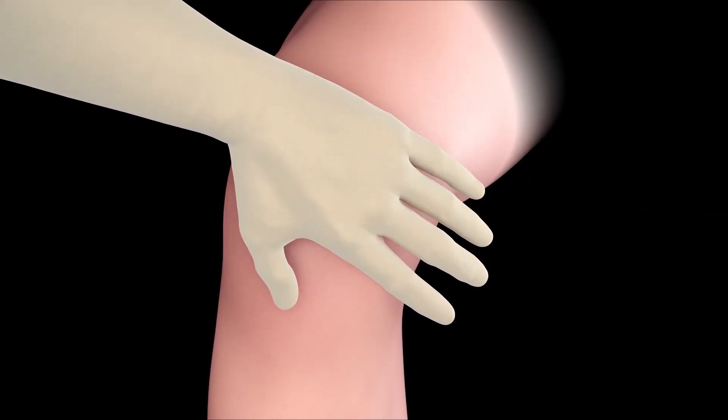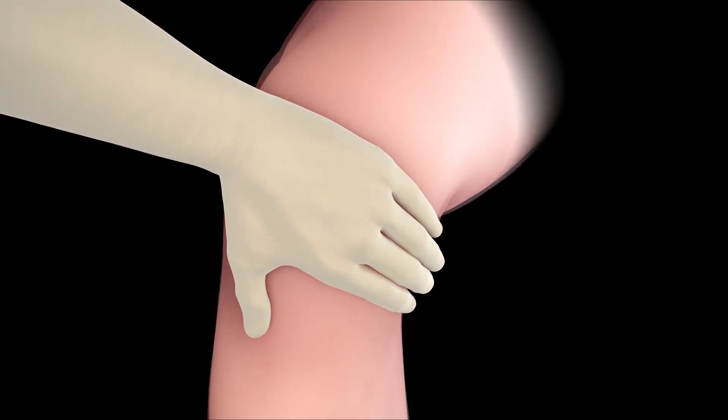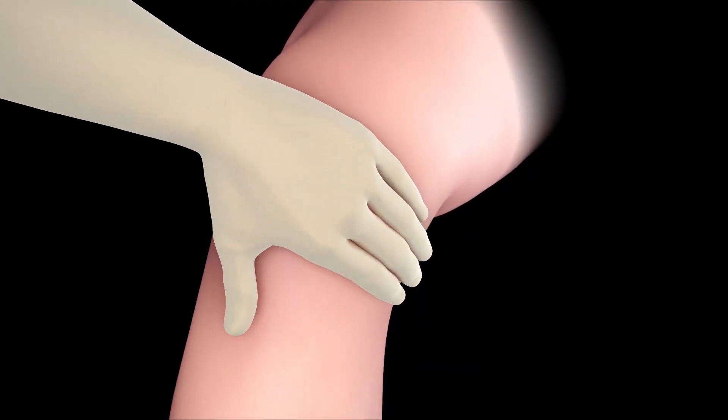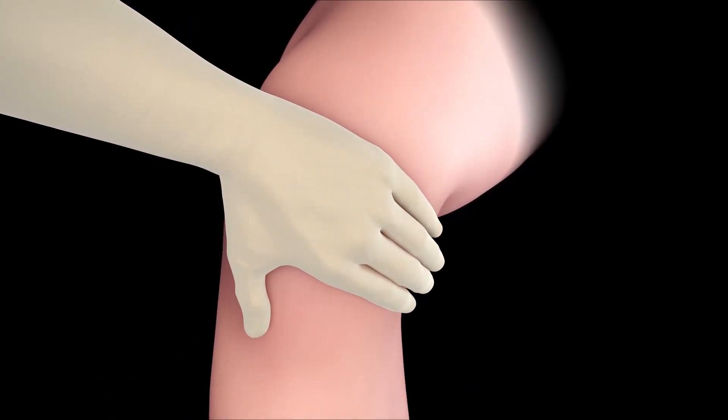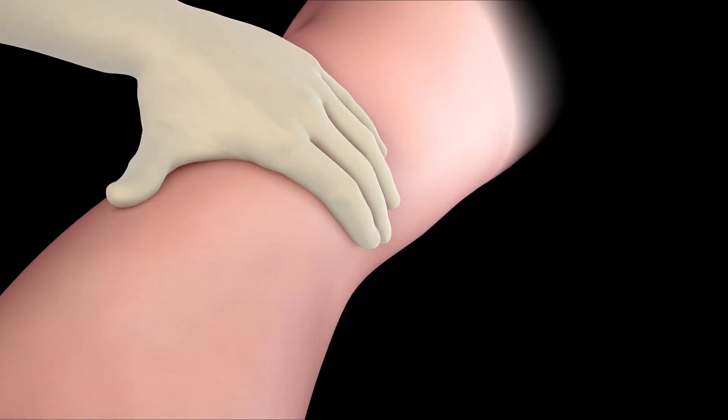Further fibrin sealant may also be applied to the rim of the implant. Finally, fully flex and extend the knee several times, and then inspect the implant to ensure it has remained in place. The implantation should be followed by an appropriate physician-prescribed rehabilitation program.